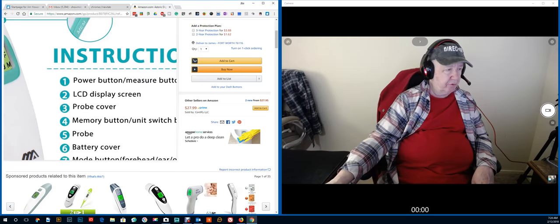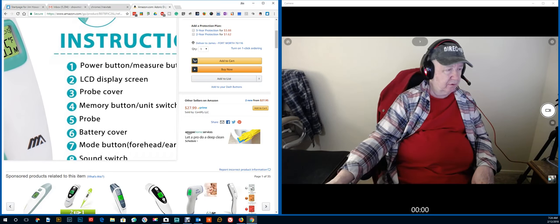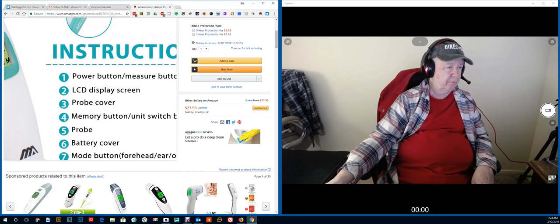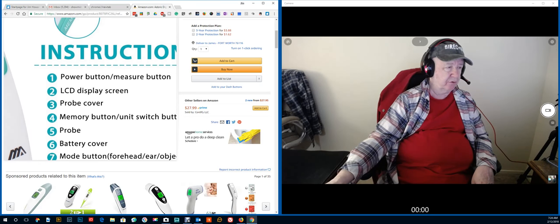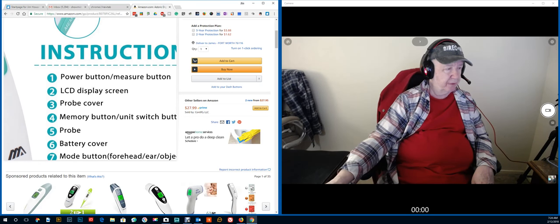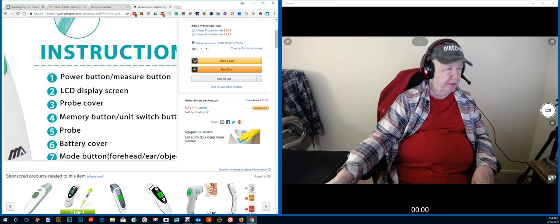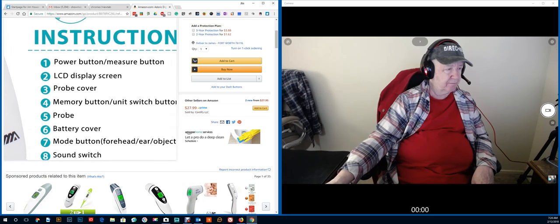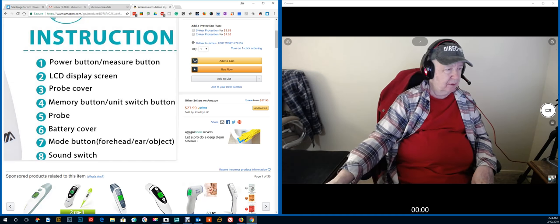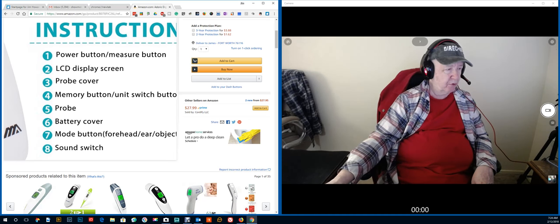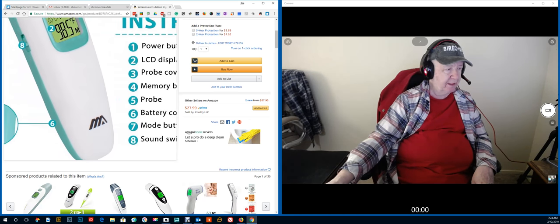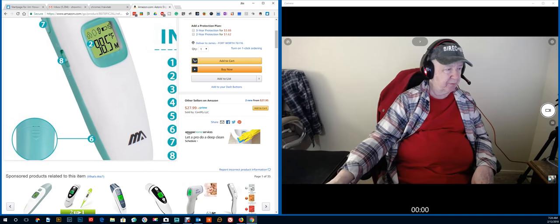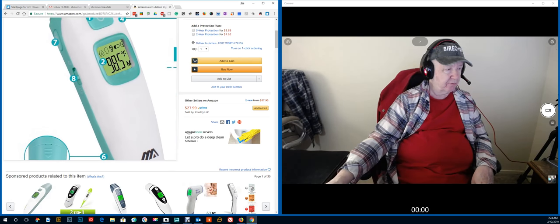And of course you want to set this for Fahrenheit or centigrade. And there, these are your buttons. Well, no, it's other objects too. Power button and measure button. LCD to screen, the probe cover. Memory button. Probe, battery cover. Etc. I'm going to sneeze. Probably better.